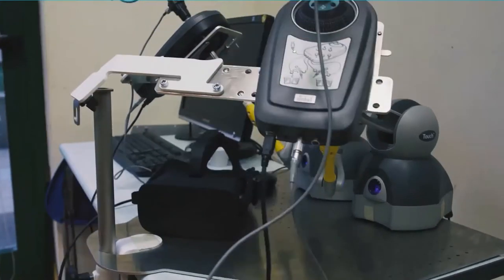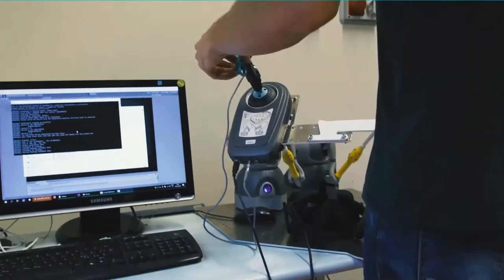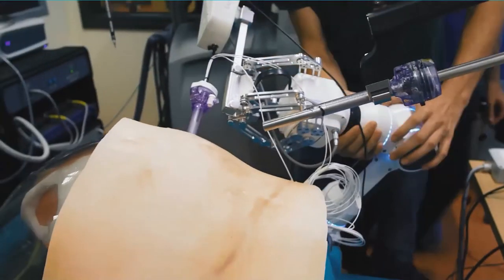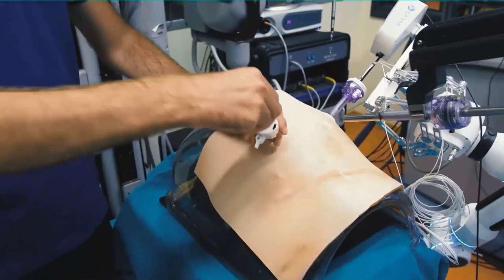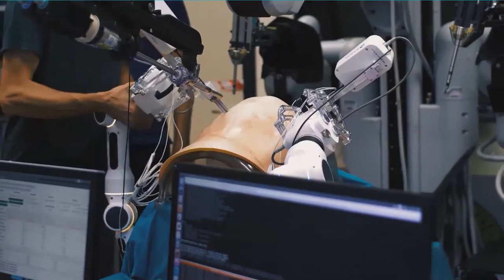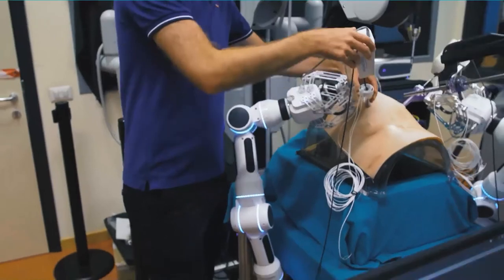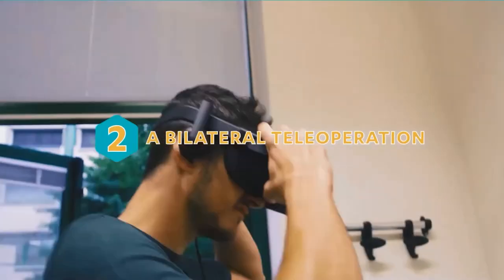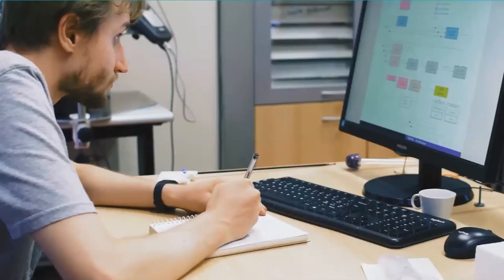The SARAS system will autonomously perform specific tasks currently carried out by the assistant surgeon during a robotic or a laparoscopic procedure. Since 2018, the SARAS consortium focused on the development of: 1. A pair of robotic arms to be fixed directly on the operating table, controlling off-the-shelf laparoscopic tools. 2. A bilateral teleoperation architecture to allow remote control of the SARAS arms by the assistant surgeon.